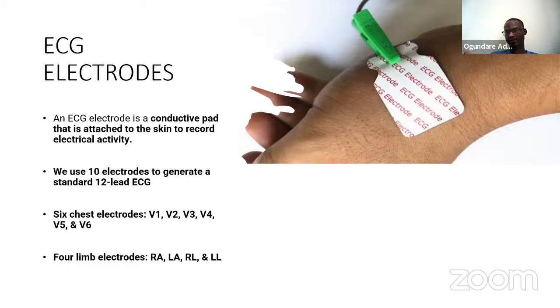Most times they are color coded, but it's best to read the label. Don't be proud, just read out the label, because the color is different from Europe to America. You understand the red, yellow, green, black norms, but it's not always like that.